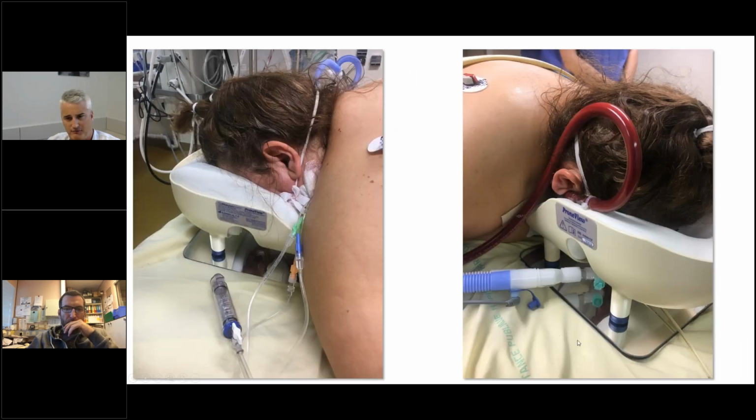And this is just an example of a patient that we proned in my department. We use a dedicated helmet which secures the head of the patient, and also secures the jugular cannula. This way, we do not need to move the head of the patient, and we keep both arms along the patient's body. With this mirror, you can have a look at the endotracheal tube. You can also check every hour that there is no compression of the eyes of the patient, and it will also avoid any kinking of the endotracheal tube.